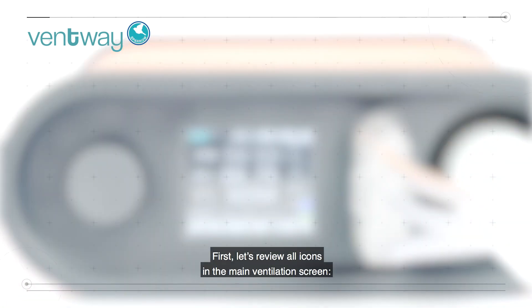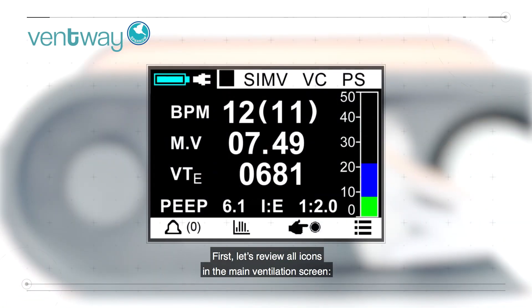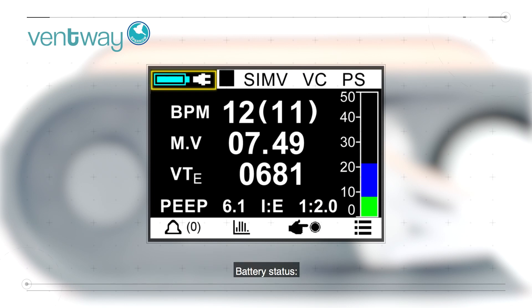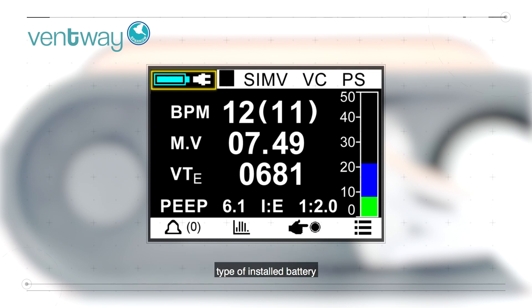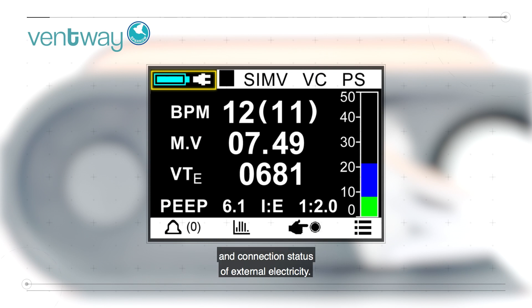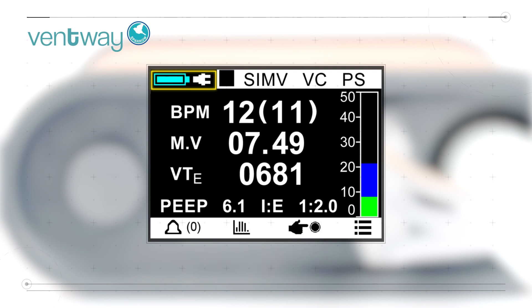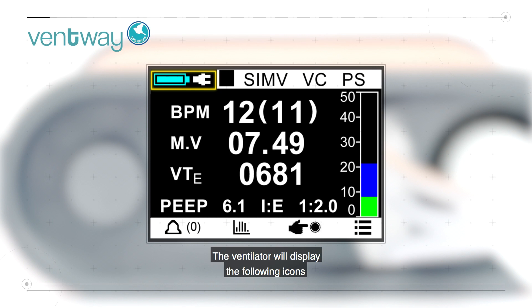First, let's review all icons in the main ventilation screen. Battery status is an indicator for the battery charge level, type of installed battery, and connection status of external electricity. The ventilator will display the following icons to indicate the different power status of the device.